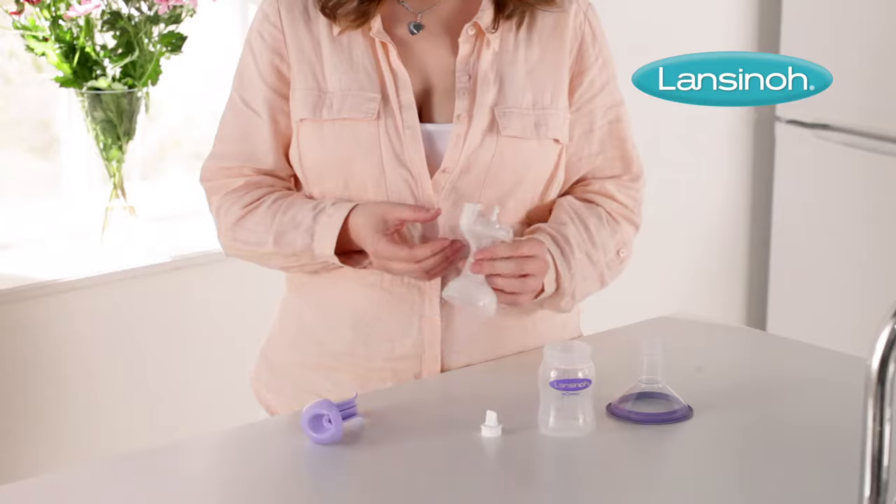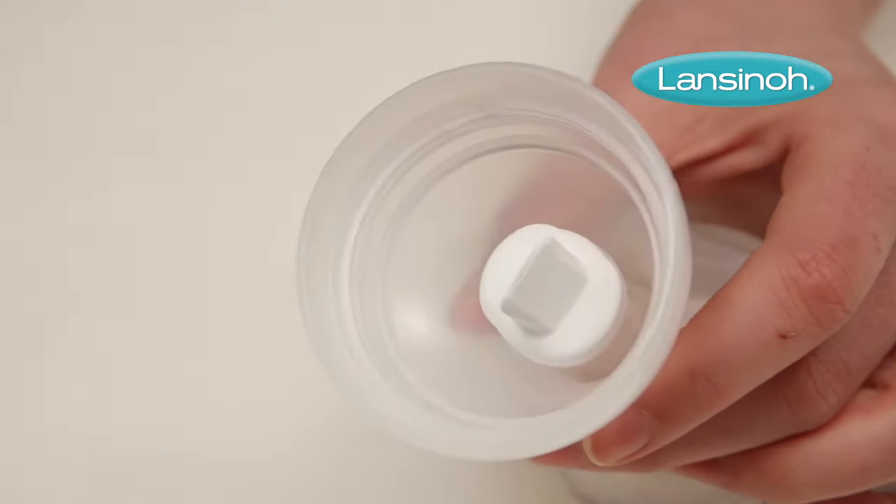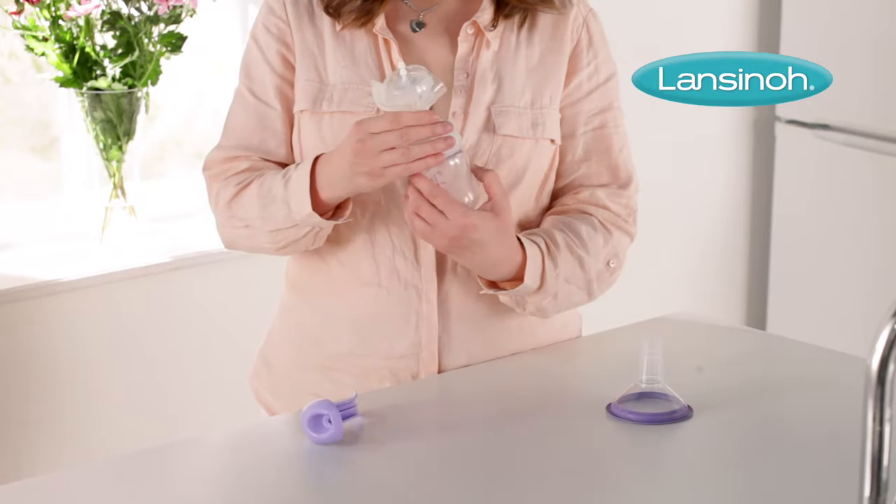Next, you need to secure the white valve onto the pump from underneath, making sure the white valve is flush with the pump body. Then screw the bottle onto the pump body.